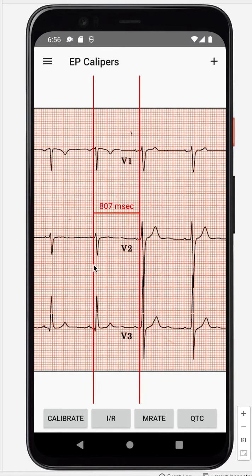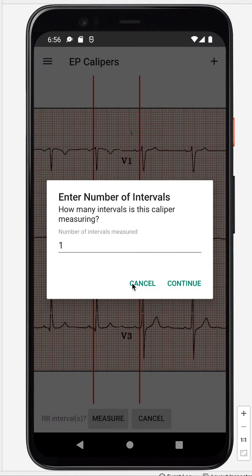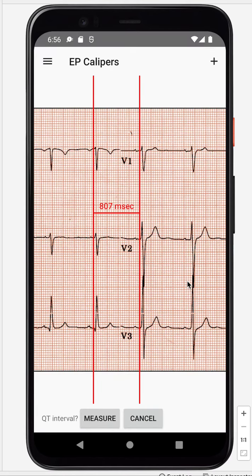Make one right there, then hit QTc. We've measured the R-to-R interval, and we're only measuring one R-to-R interval, so we'll leave the number of intervals as one. Hit Continue.